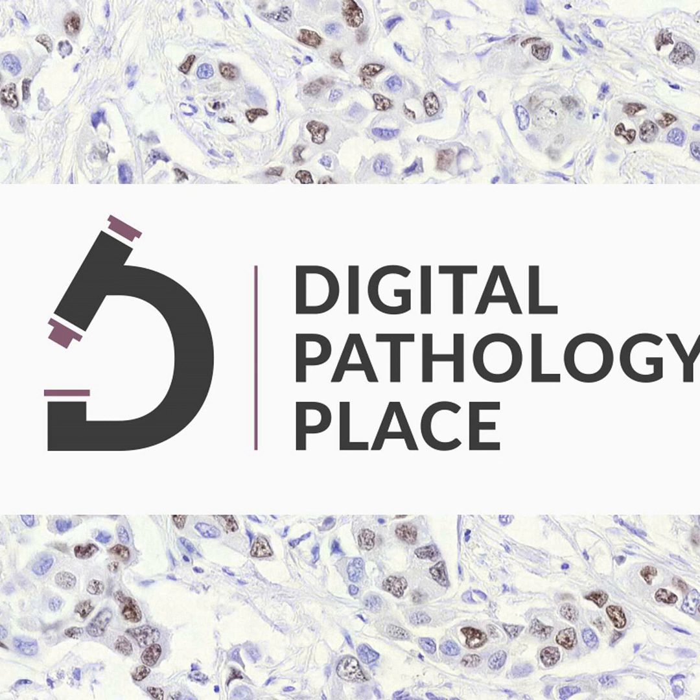It's pathologists and the clinicians and anybody else who is much more familiar with the data that can tell me more about the patients it was collected on, how it was collected, are there different batch effects, some collected from some medical centers and others from others, was there a different process followed for annotation for some of the data, and something in the annotation process changed partway through, and so the other portion of the data set has a different process that was followed. Anything like that that can bring context around what the data is composed of and what the upcoming challenges are.